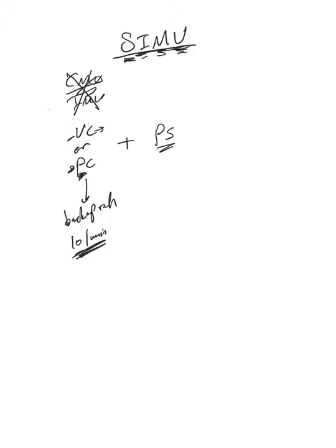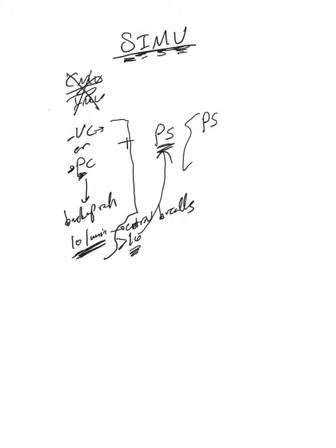And now any extra breaths above these 10, the mode will immediately switch from this to pressure support. Any extra breaths above the backup rate, the mode will automatically switch to pressure support, where we provide pressure support, and the cycle here is a flow cycle, if you remember pressure support ventilation.